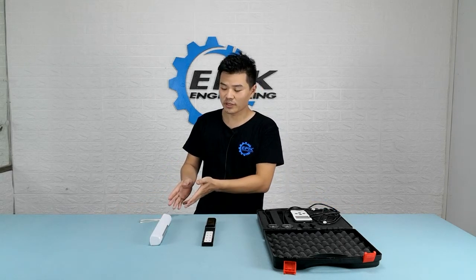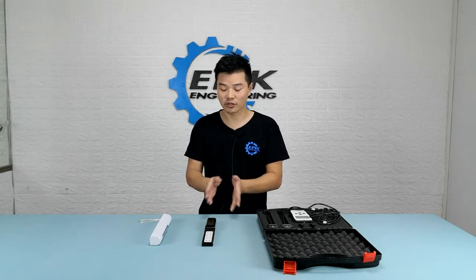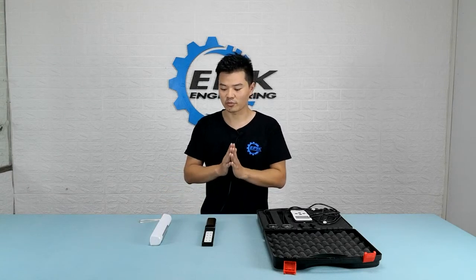Both of these put out four watts of power. The white one runs on four AA batteries, which I have just changed. And the black one has a built-in lithium battery, which is fully charged at this point. So later on when we test these, the battery is not going to be an issue.